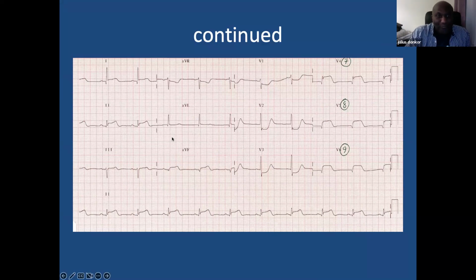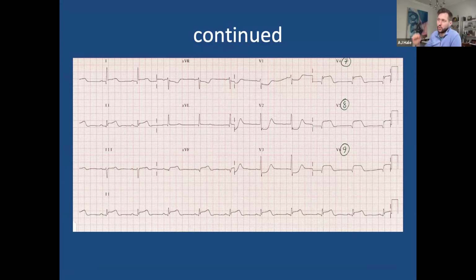Is there a risk of false positive with V1, V2, V3 being negative, where you would need to do V7, V8, and V9? Or if you're negative in V1 through V3, is that a pretty strong indicator it's posterior? Spot on, spot on.